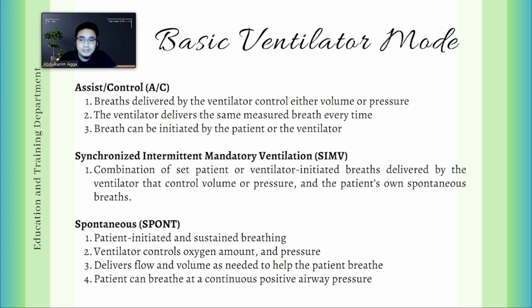On the other hand, when we talk about synchronized intermittent mandatory ventilation, most commonly heard as your SIMV mode, it is a combination of a set of patient or ventilator-initiated breaths delivered by the ventilator that control volume or pressure, and the patient's own spontaneous breaths.